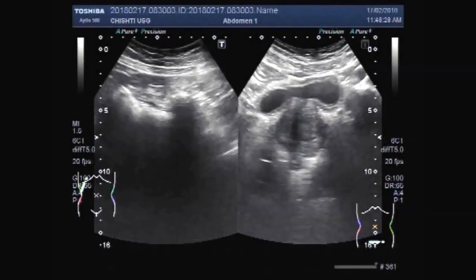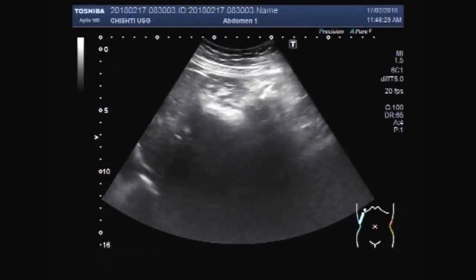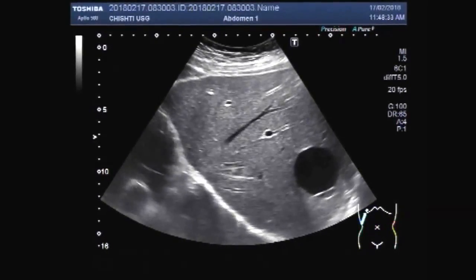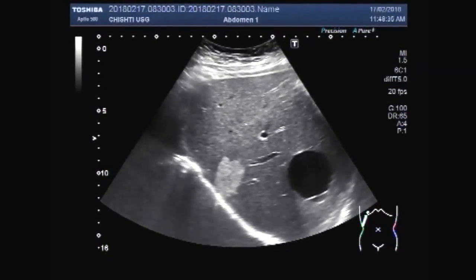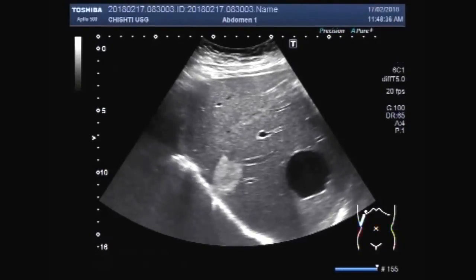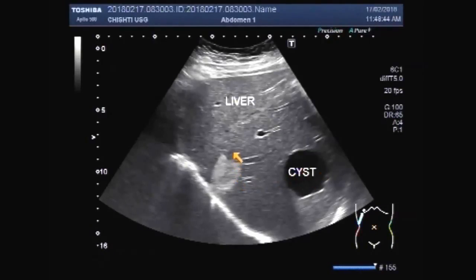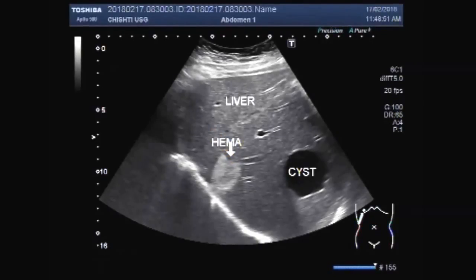Dear viewers, I hope you are all fine. This ultrasound video shows a hemangioma in the middle portion of the left lobe of the liver, and two cysts, possibly hydatid cysts, seen in the lower and middle portion of the right lobe of the liver.